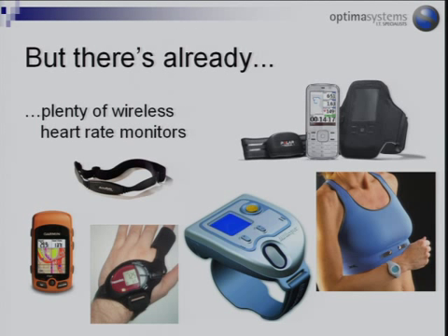Nokia is in the process of releasing a new phone called N79 Active or something, which has a polar strap that is using a Bluetooth wireless connection rather than the previous standard wireless technology that Polar is using. Which name I can't remember now, but when I started working on the project, I was open to use Polar and failed because they didn't use the Bluetooth technology to communicate. So Nokia apparently has power enough to convince them to change technology, which I didn't have.